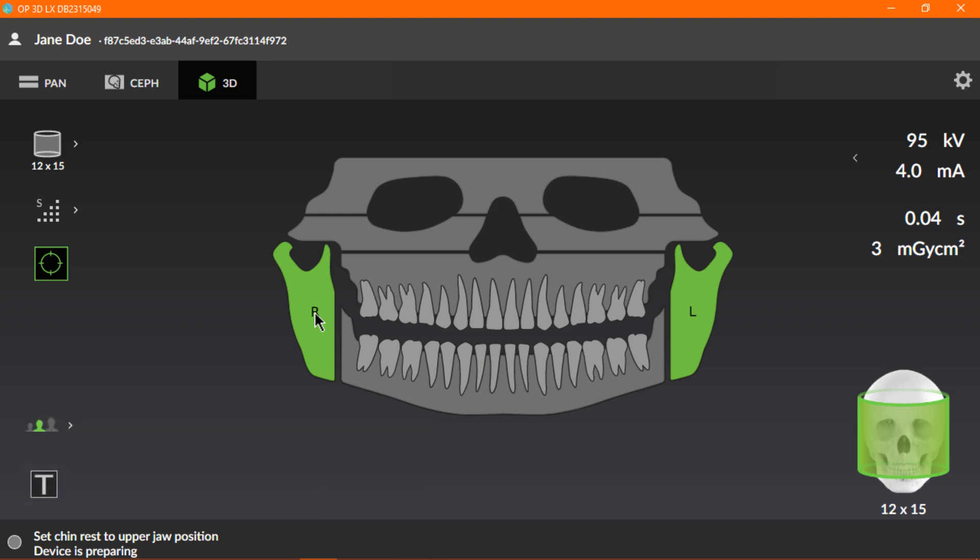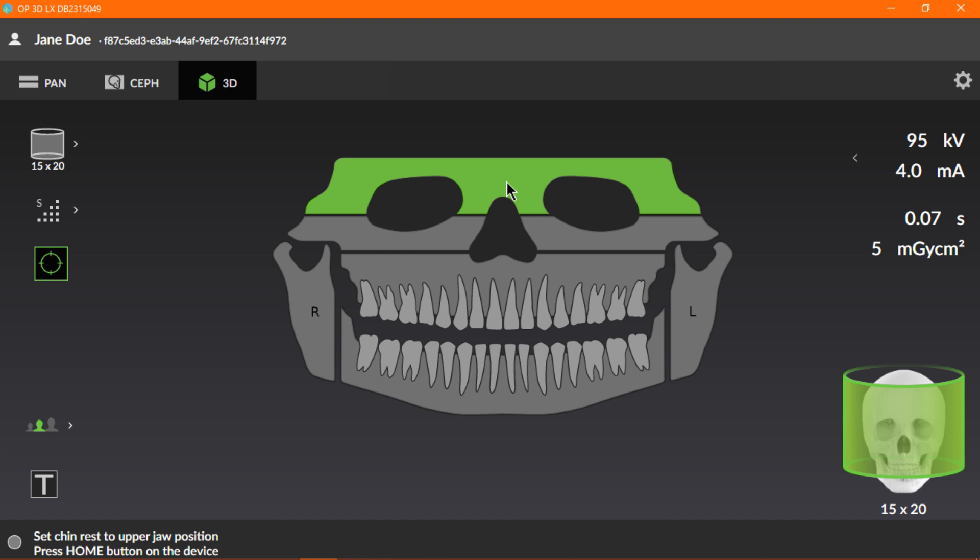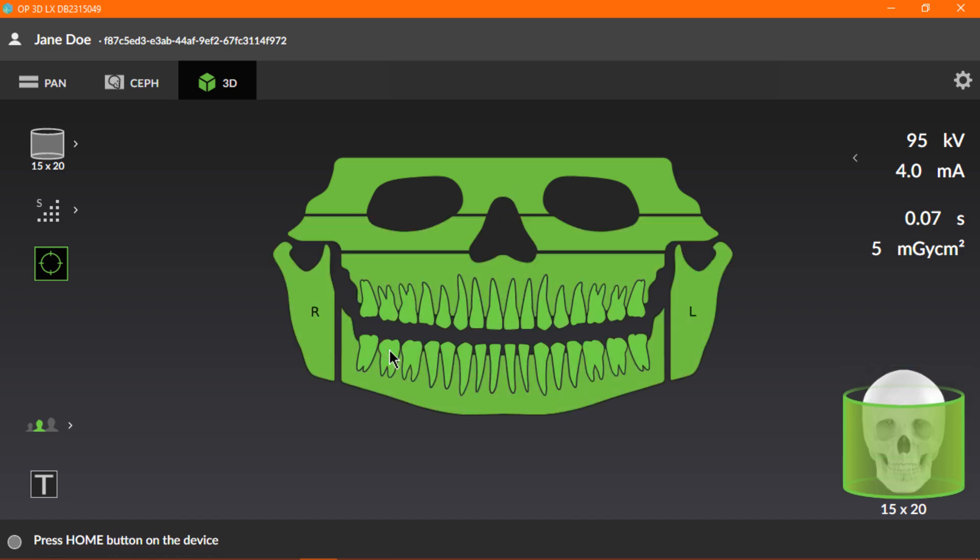You can also select the maxillary sinus, frontal sinus, or the whole dentition by double-clicking any single selection, tooth, jaw, or TMJ. Undo the Select All by double-clicking the selection to return to the previous state.